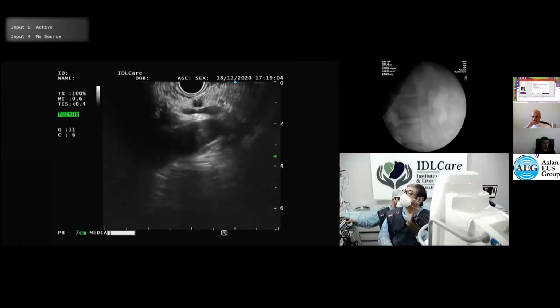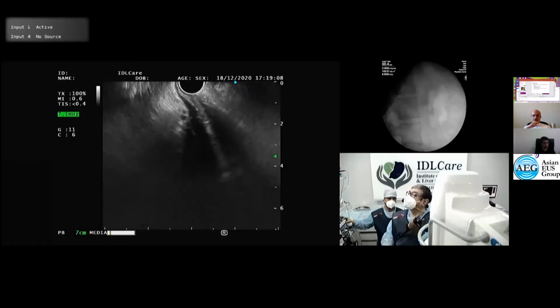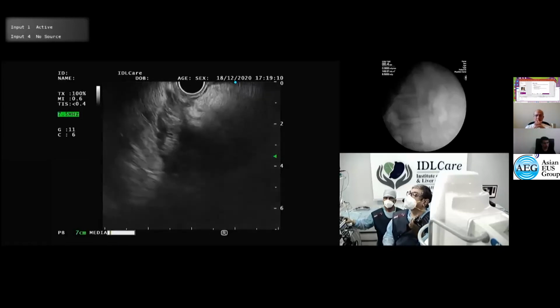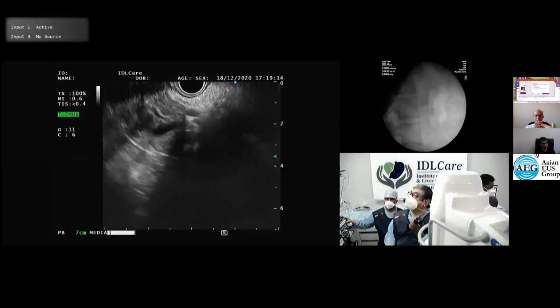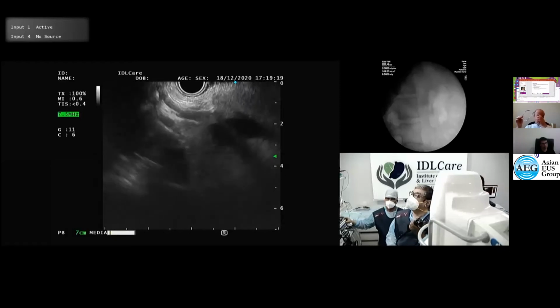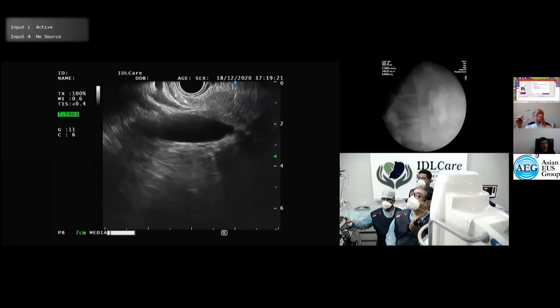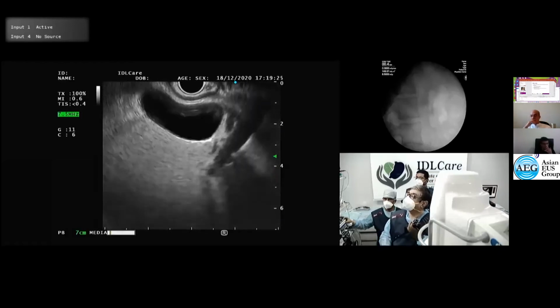Aorta. Now, just a quick question. 2 minutes. The initial stricture was just in the same place as you are seeing the next stricture now? Yes, exactly the same place. So now I am trying to get this in position. I am not seeing the duct because I changed the position of the patient. So give me 2 minutes.